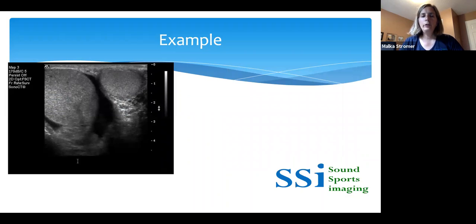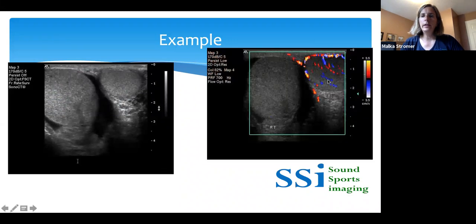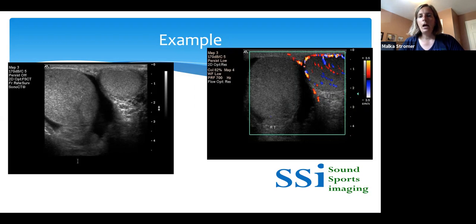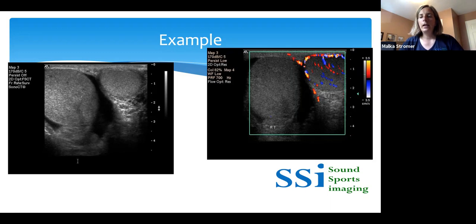Here's an example of two testicles within a scrotal sac — they're fairly isoechoic, though one may be slightly more hypoechoic and is definitely larger. This is a young man who came in with acute onset of scrotal pain. Utilizing our tools, we can see the left testicle has lit up nicely with blood flow, but there is zero blood flow within the right testicle. This is an emergency — this patient needs to go to the operating room due to torsion. There may be a possibility to detort the testicle, but it may have already lost viability. The hypoechogenicity and increase in size with decrease in echogenicity is associated with acute testicular torsion.